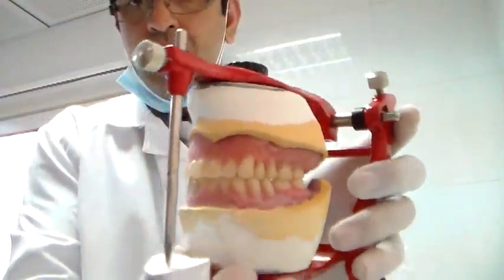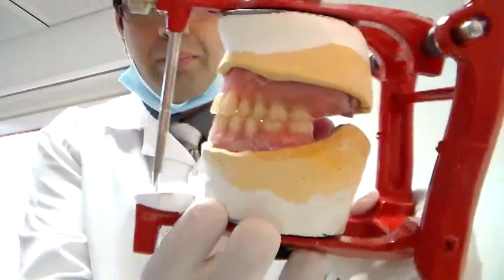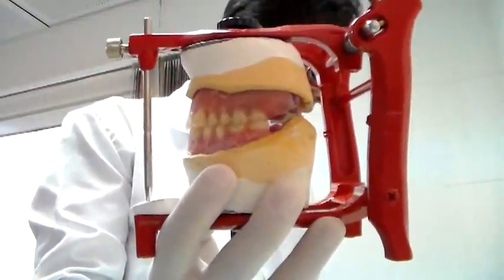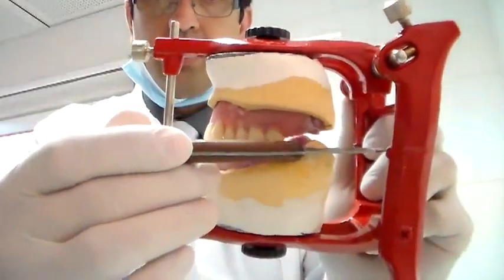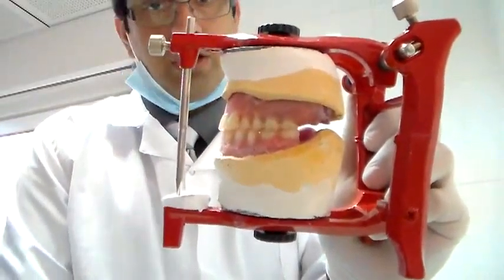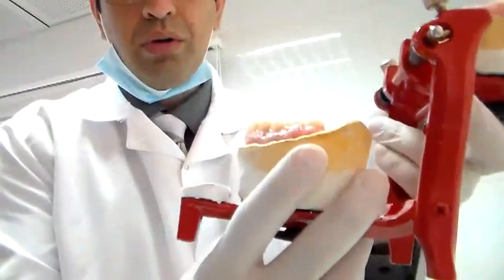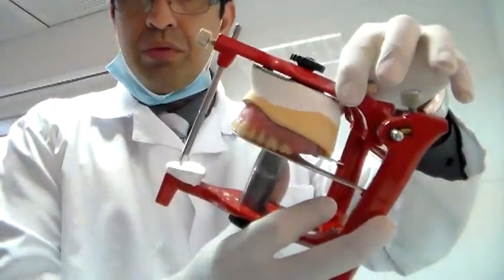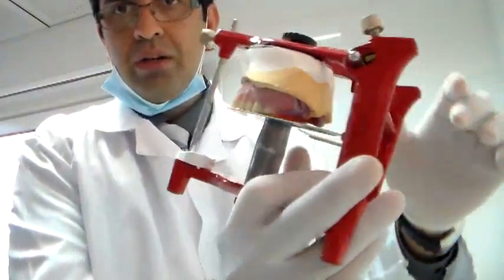After this, you want to check for the plane of occlusion. The way you can check the plane of occlusion is to just compare — get an instrument — and compare with this posterior notch here of the table and see if the plane is passing through the posterior notch. If you have any doubts, you can always just mount the mounting table. Once the mounting table is mounted, you can check if your teeth are set in the right occlusal plane.